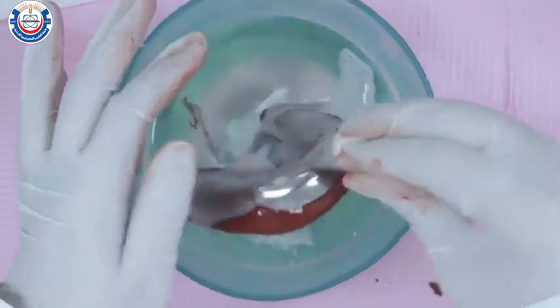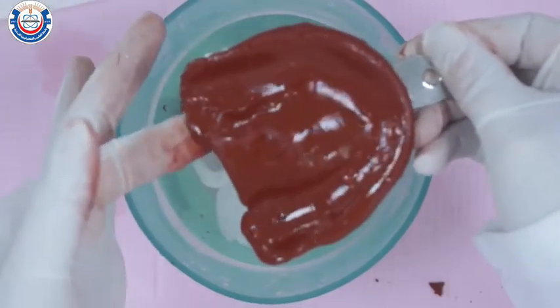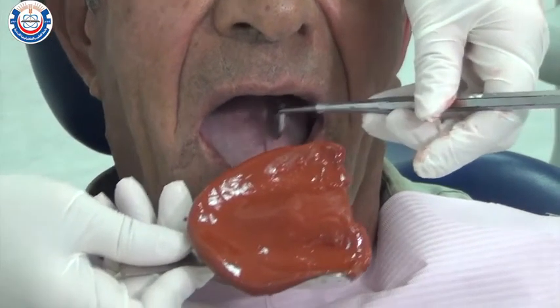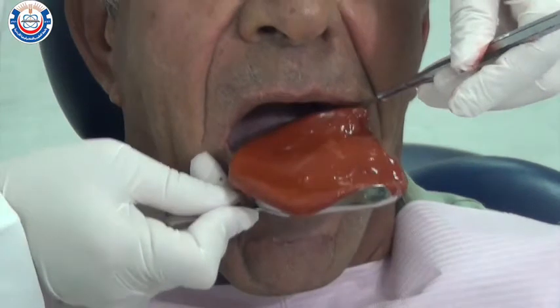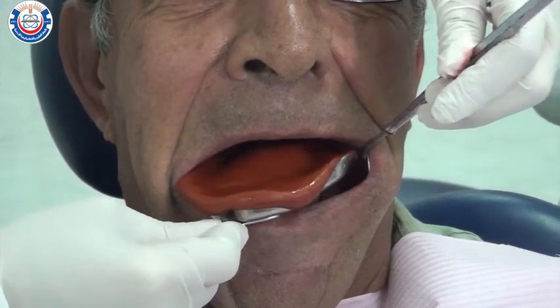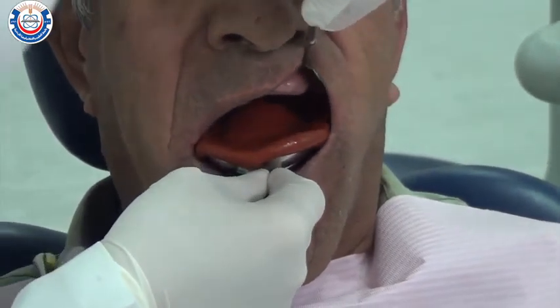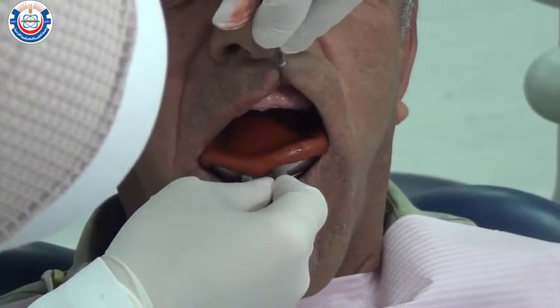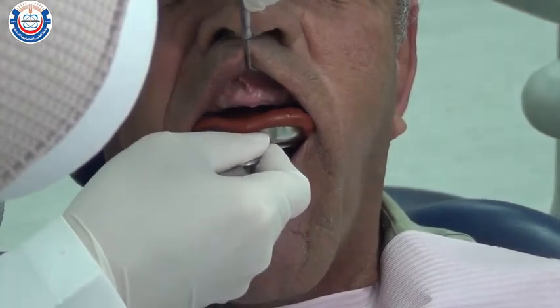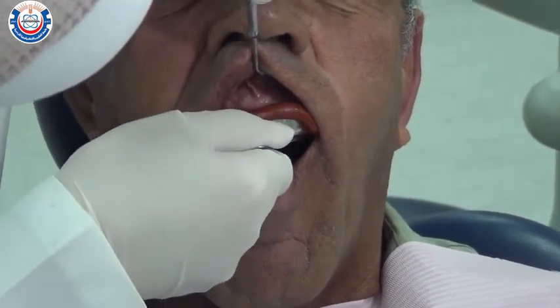Reheat the material one last time before introducing it to the patient's mouth. Stand behind the patient. Use a mirror with your non-dominant hand to retract the cheek and use the tray itself to retract the cheek on the other side. Rotate the tray gently into the patient's mouth and seat it posteriorly, distal to the maxillary tuberosities. Retract the upper lip with the mirror to provide visibility. Once the tray is centered over the ridge, push it gently until the impression is seated correctly.